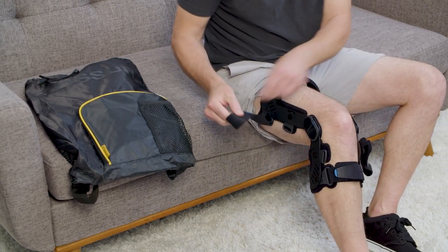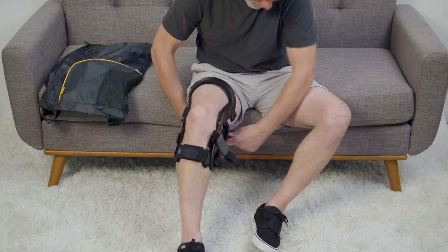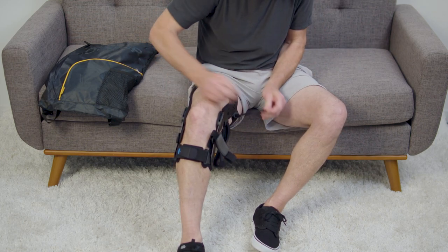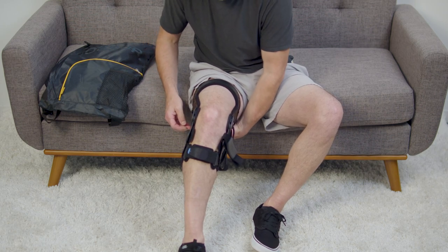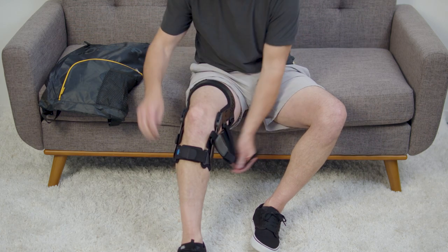Next, insert the upper thigh strap through the D-ring and fasten. Continue with the lower thigh strap.